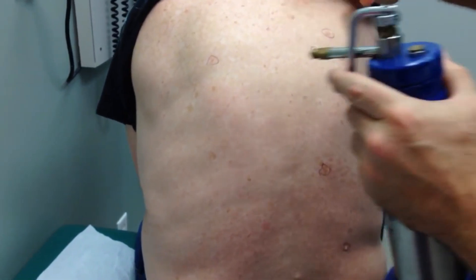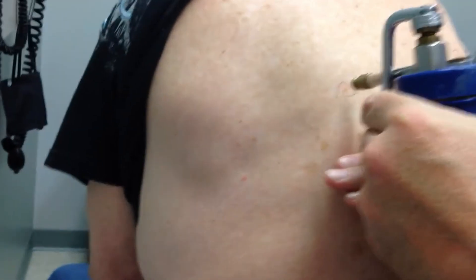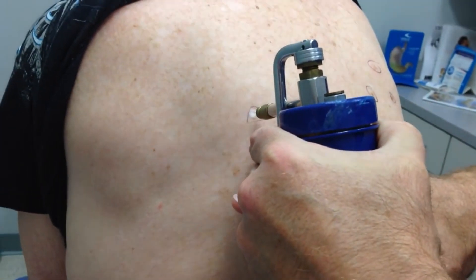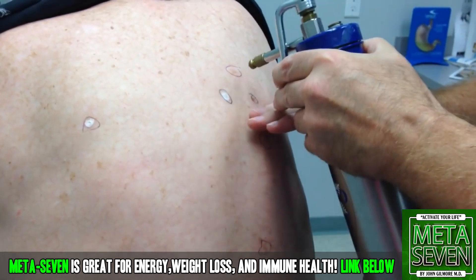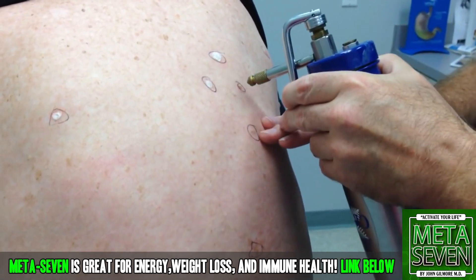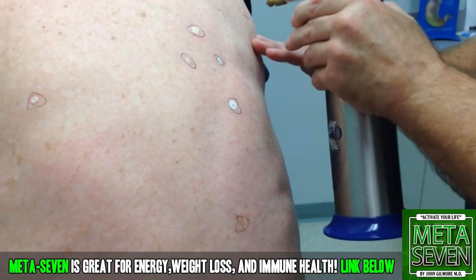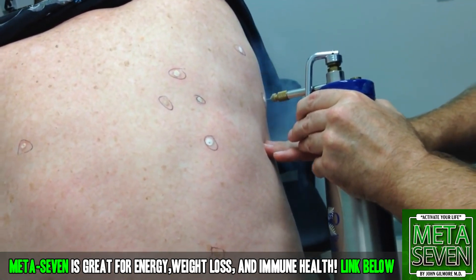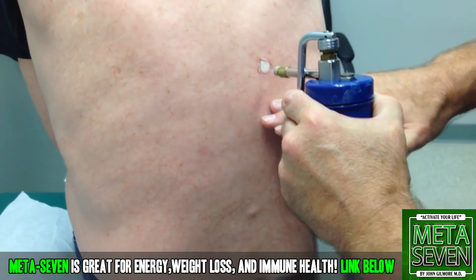We have to freeze all of these twice, okay? So here we go — get ready. Remember, the most important thing is I won't feel a thing. I'm getting close to the end here.